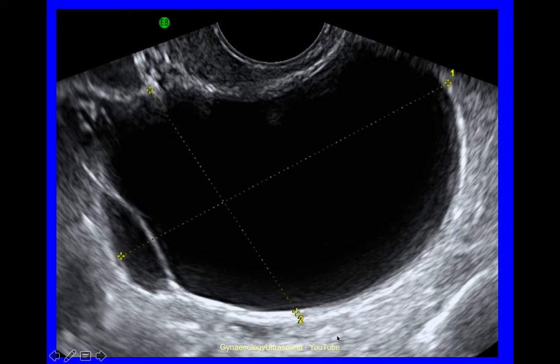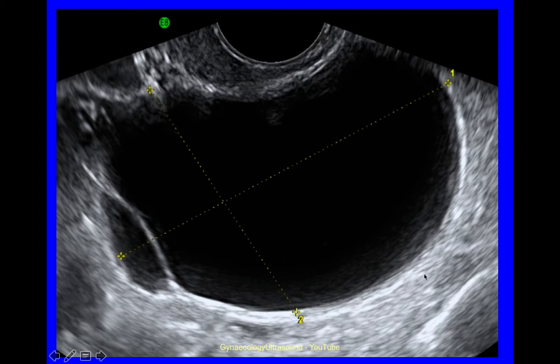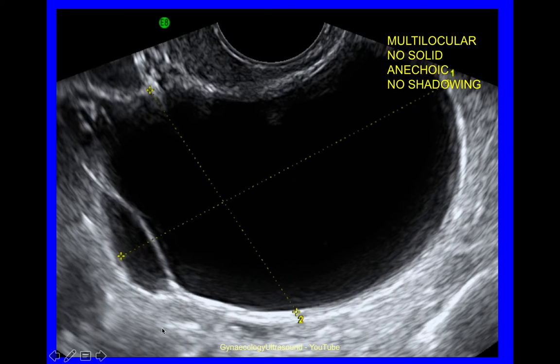In this example the cyst is multilocular — here's one locule and there's another with a thin regular septum, no solid material, anechoic cyst contents, and no posterior shadowing. Always look carefully for shadowing behind the cyst. So that cyst was multilocular with no solid material, anechoic with no shadowing.